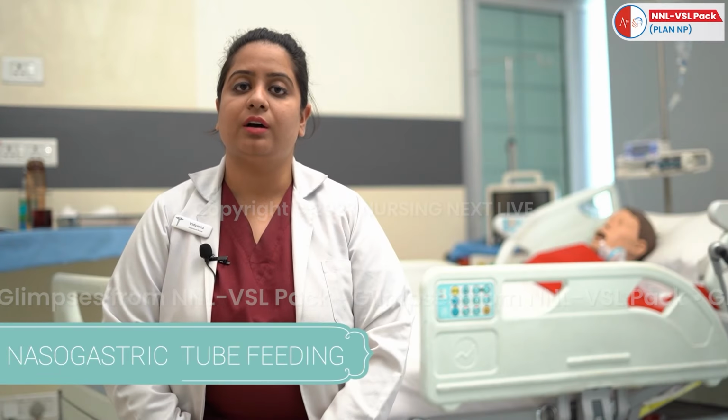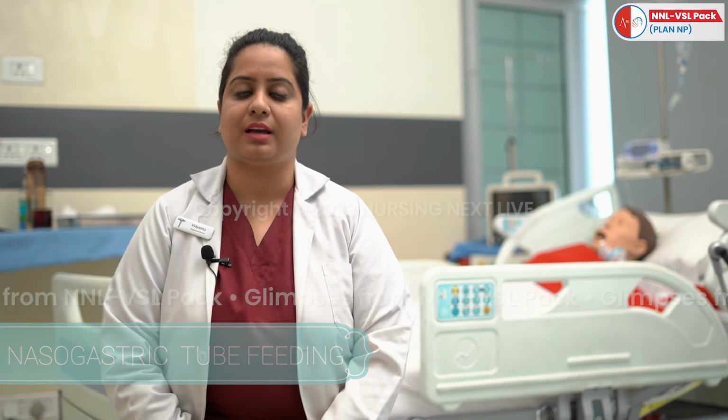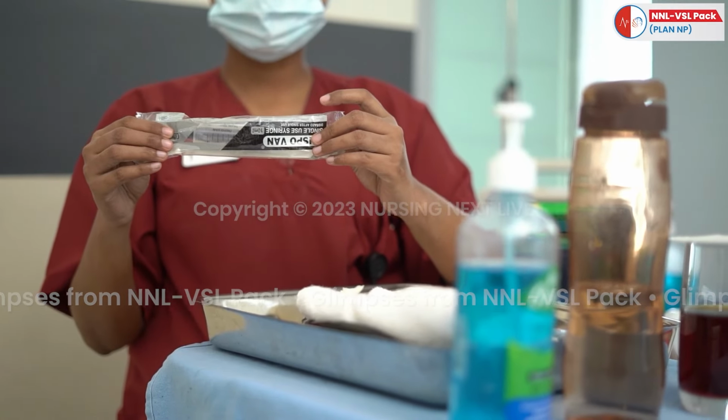In this video, a nurse will understand the various aspects of nasogastric tube feeding, steps of procedure, equipment required, after care, and most importantly, what to do when things go wrong. In other words, common clinical errors. Let's understand the concept of nasogastric tube feeding. In this procedure, a nurse will administer the feeding directly into the stomach through the nose, which provides adequate nourishment to the patient who cannot feed himself or herself.